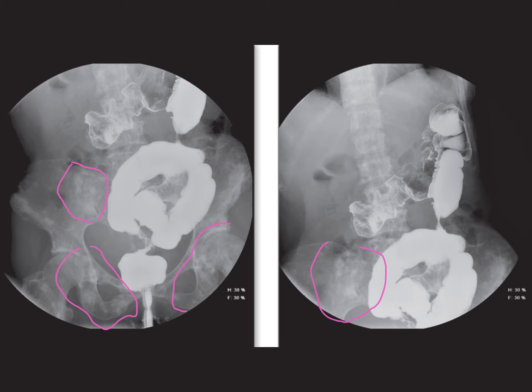The imaging findings are consistent with this scenario, necessitating a thorough evaluation. When encountering strictures on a contrast enema, it's essential to consider a broad range of differential diagnoses, including neoplastic, inflammatory, or infectious processes. Neoplastic processes can be primary — such as the classical apple core lesion typical of annular carcinoma — or secondary, as seen in metastatic diseases. Synchronous lesions are more frequently associated with predisposing conditions like familial polyposis or inflammatory bowel disease, which heighten the risk of multiple lesions.